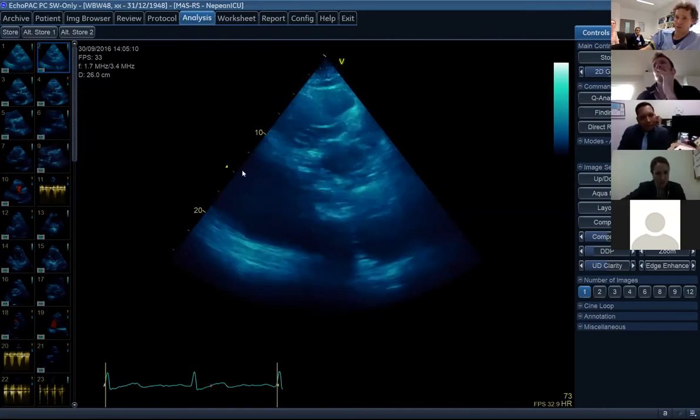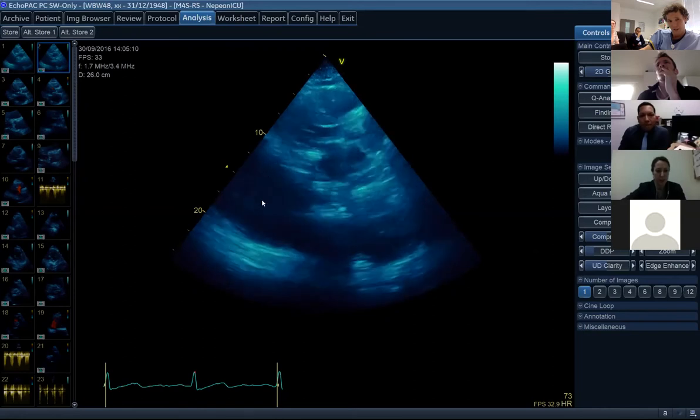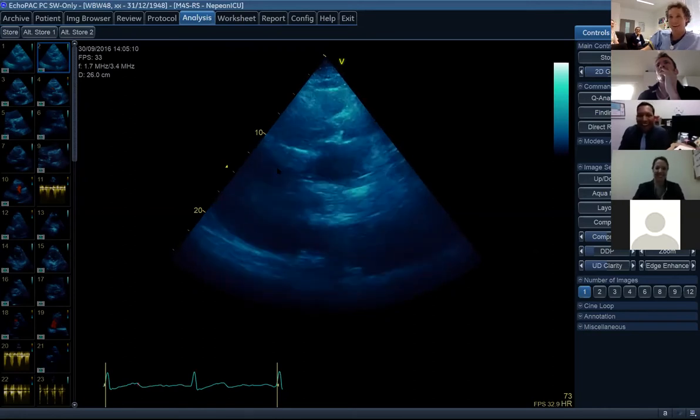This is almost getting up to sort of... And it's very large. It's huge. I don't think we'll get pericardial effusions this big. Yeah, I'm surprised that anyone tried to extubate her, honestly. Yeah, fantastic. It could have been me, but I do hope not.